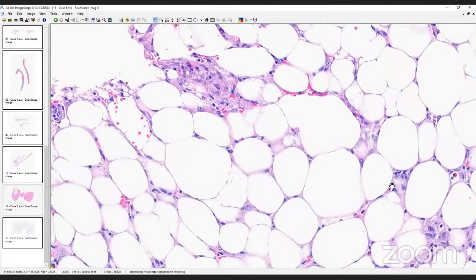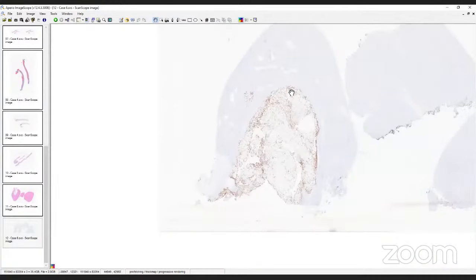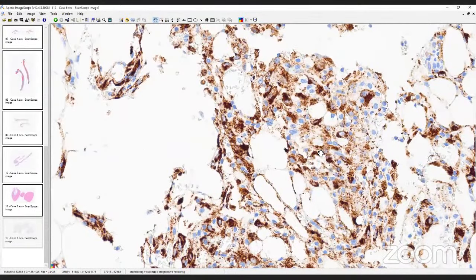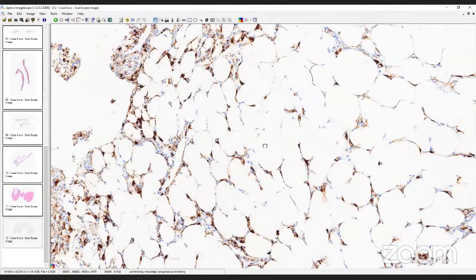Now, the other thought that came to mind was also a myelolipoma, which is a lipoma with lots of extramedullary hemopoiesis. And so, of course, the stain that you would do would be HMB45. And you see how nicely it lights up the lesion. So here we have those cells that were in between that looked a little bit fibrillary, that had this spider web appearance, and they all light up with the HMB45. And that is the diagnostic stain for angiomyolipoma. So this was a nice case of angiomyolipoma.